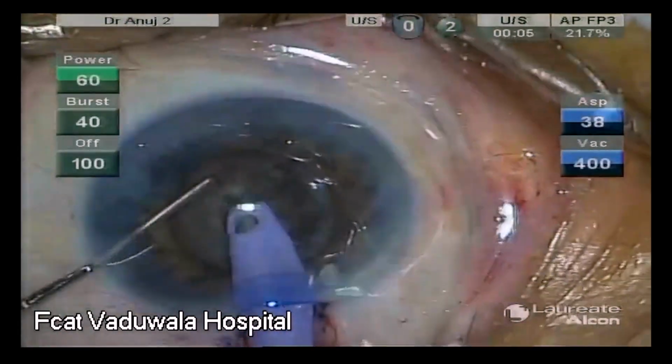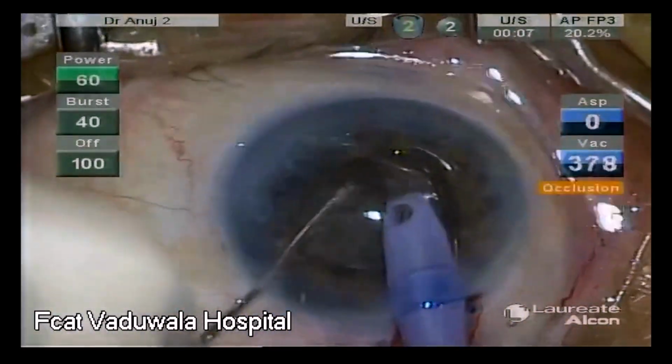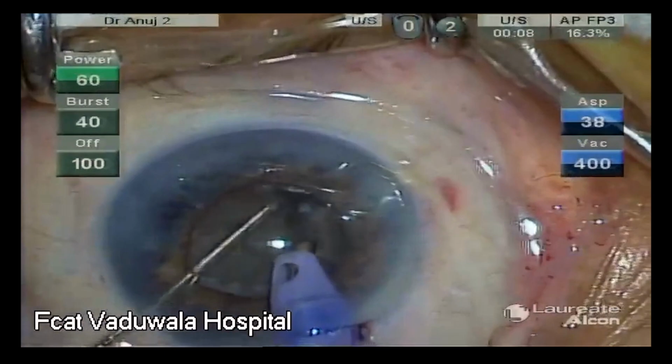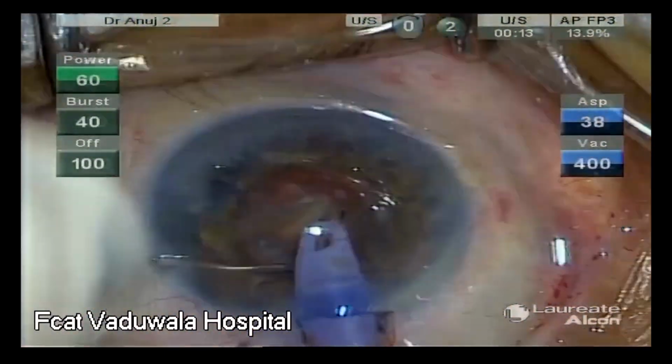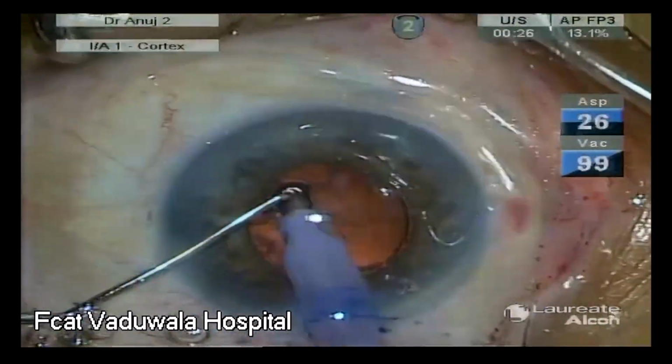The emulsification occurs piece by piece at the anterior capsular plane. A safe idea is to move towards the iris plane and switch to epinucleus mode at the time of emulsifying the last nuclear fragment.